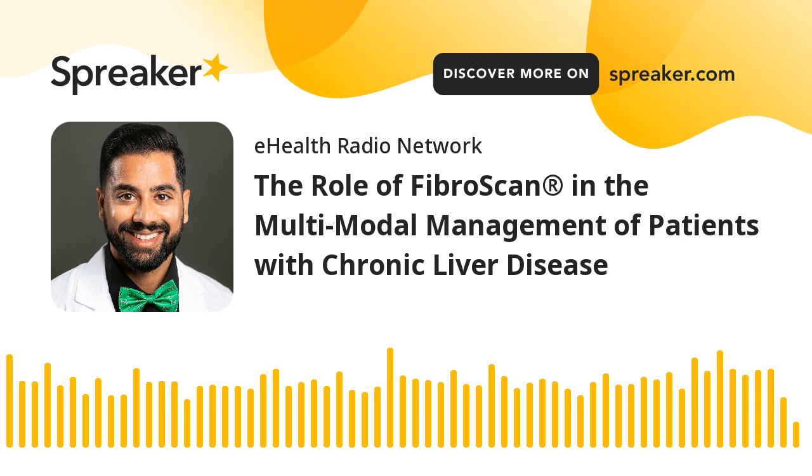So in general, when these patients are making such lifestyle changes to reverse their liver damage, we utilize the FibroScan coupled with blood work as early as 6 months in some of these patients to further elucidate this with objective data that they are achieving these goals. As weight loss is a key component of reversing this disease process, we can see an improvement as early as 5% and reversal when reaching 10%. So for our patients who continue to progress on the scans or just simply at high risk of progression of liver damage to cirrhosis, I feel these patients will benefit from a more expedited involvement of other specialists.